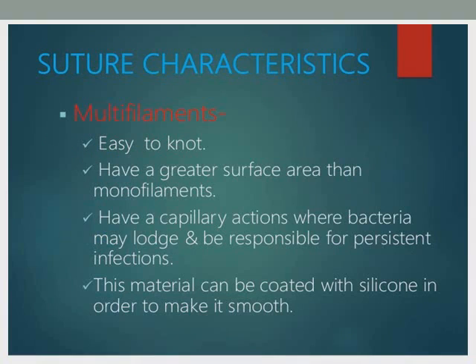هسه نجي على multifilaments. هي عكس monofilaments, easy to knot, have a greater surface area than monofilaments, have a capillary action where bacteria may lodge and be responsible for persistent infections. This material can be coated with silicone in order to make it smooth.